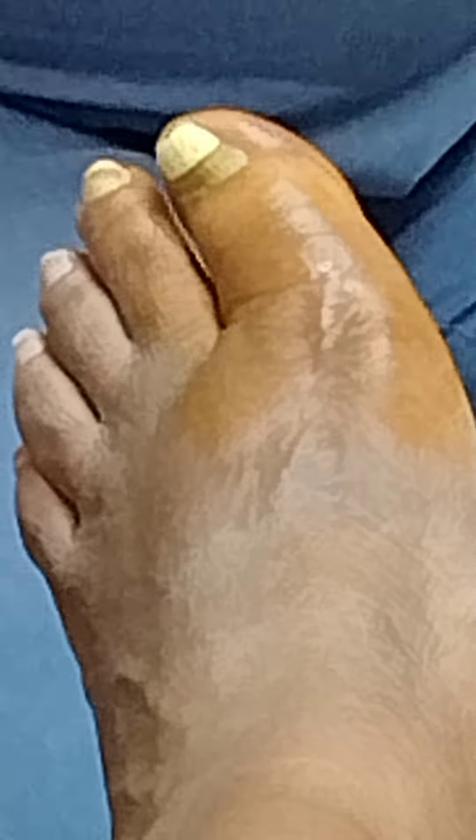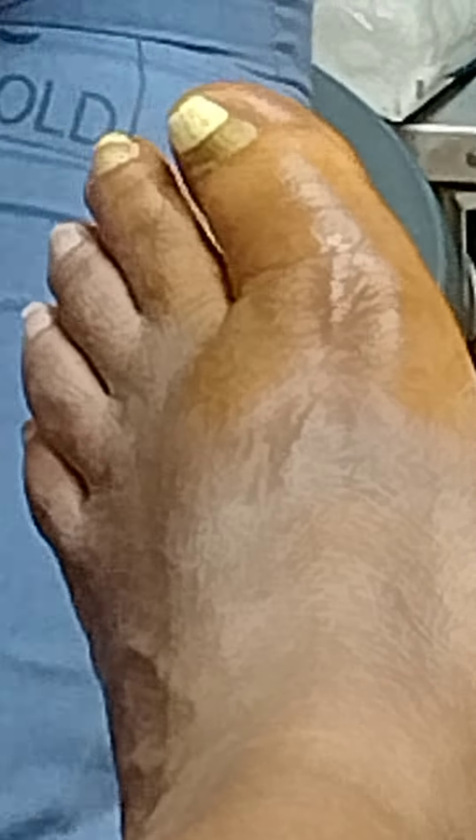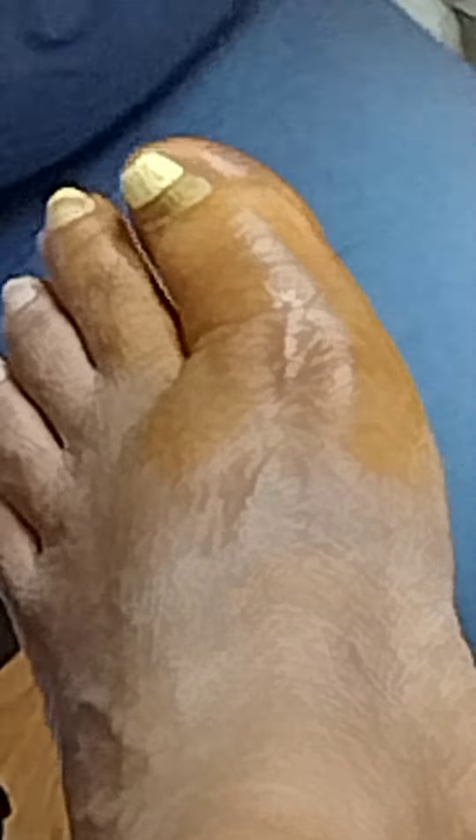Can you grab me another thing with Q-tips? So it is an actual acid burn. Acid burns, or burns in general, typically take longer. If we were just numbing it up and cutting it out, I usually tell people a week to 10 days, because the older you get, things take a little bit longer to heal. So the acid makes it take longer.